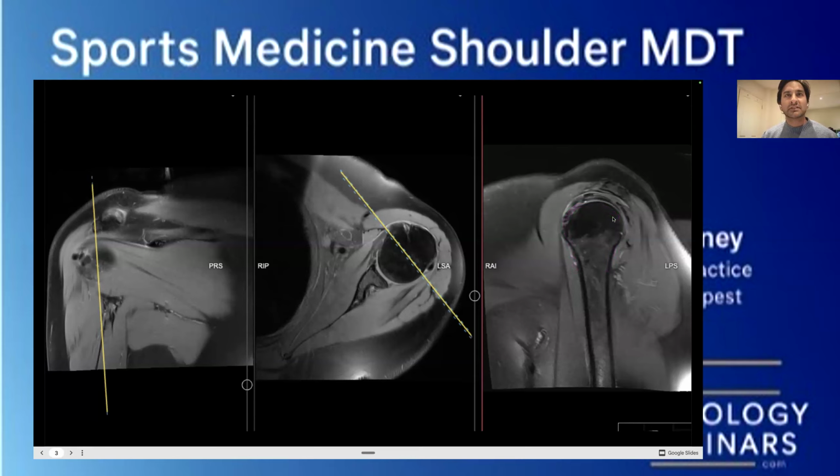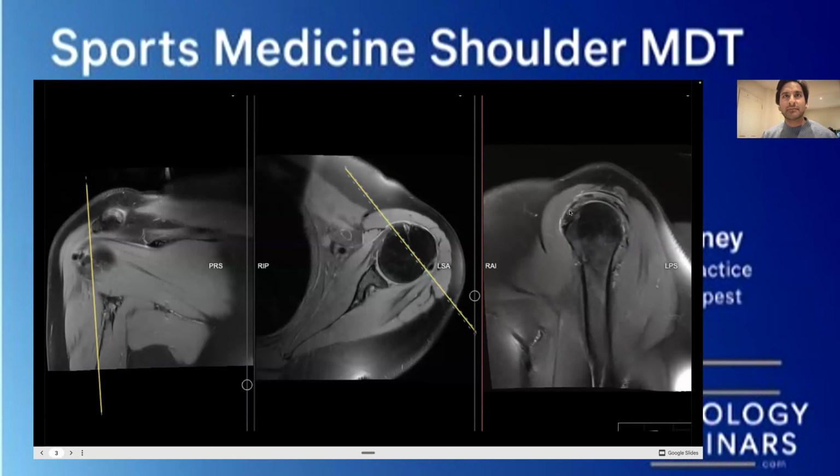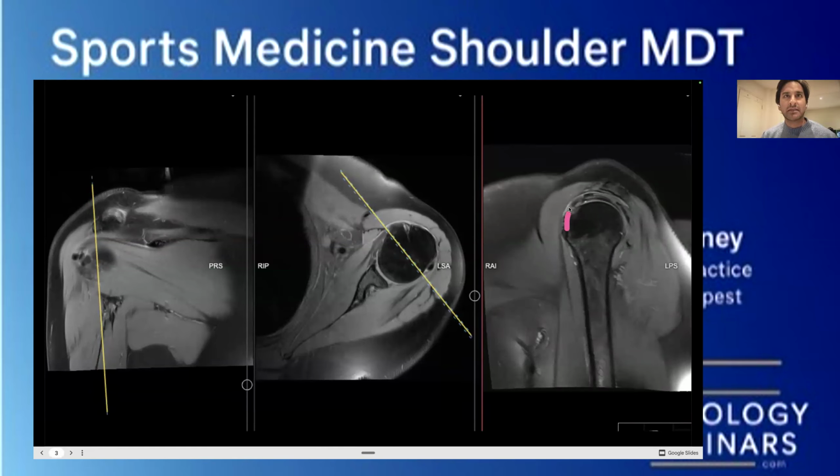And so what you'll notice is that these tendons make it look like they've got hair. They've got hair there, a bit of hair there, and a bit of hair there, and that actually corresponds to the subscapularis, infraspinatus, supraspinatus, and yes, you do have a bit of biceps tendon there. Why is this interesting? It's because when you think about it, tendons are not just tiny little threads. They're like sheets, like bed sheets that go along like so. So what can happen is that you can have a partial thickness tear where only some of it's gone.